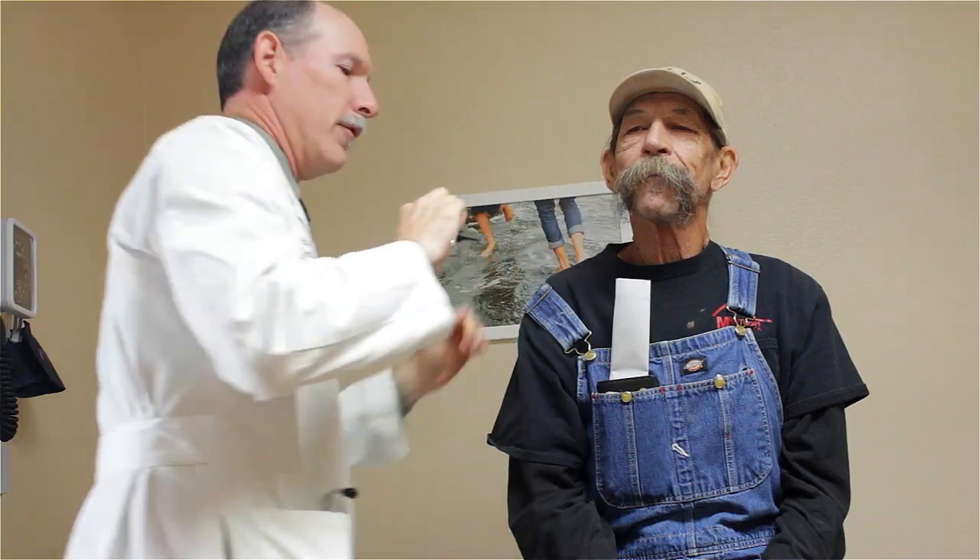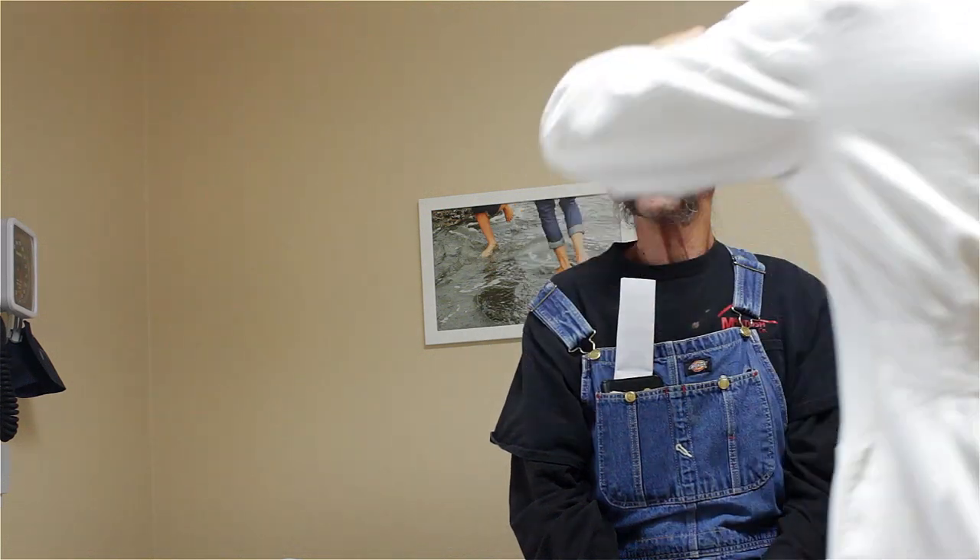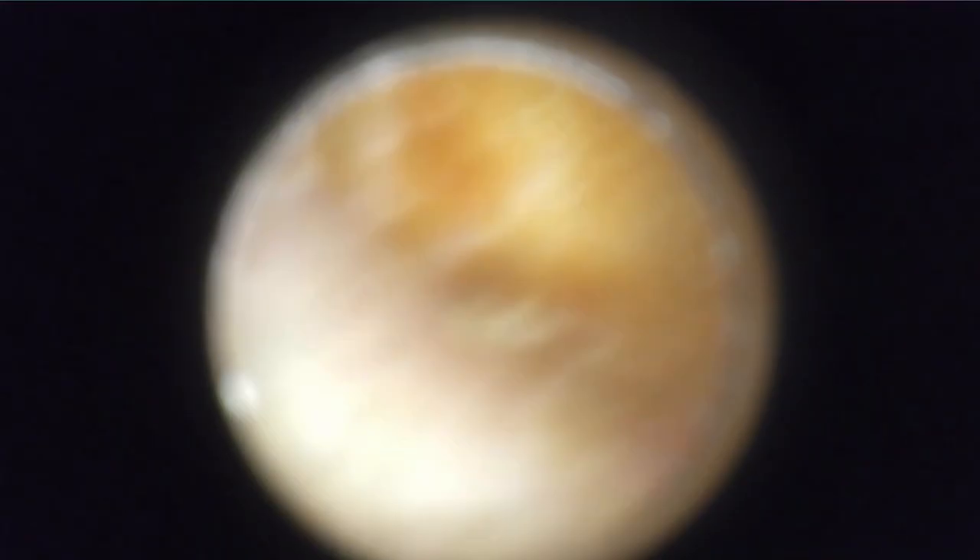You have an ear full of wax, just plugged in. Can I look at the other side too, just to see? Just because I like looking in ears. This one is also blocked, but we can let you keep using the over-the-counter stuff if it's not bothering you.